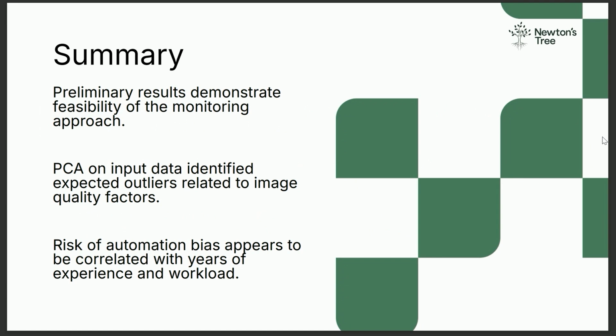So just in summary, and to give you a chance for some question and answers, we were able to demonstrate that doing real-time monitoring of third-party AI is possible in live hospital settings in a federated way, right? So the really cool thing is that dashboard that I showed you, we can log in through the internet. But none of the data is coming to us, only the metrics are coming to us. So the data is still local, so there's no data privacy issues. But us as a responsible party can observe what's happening locally.